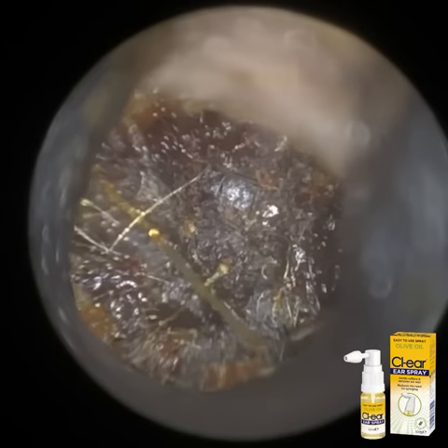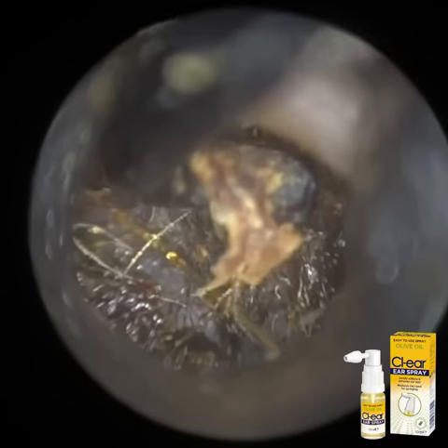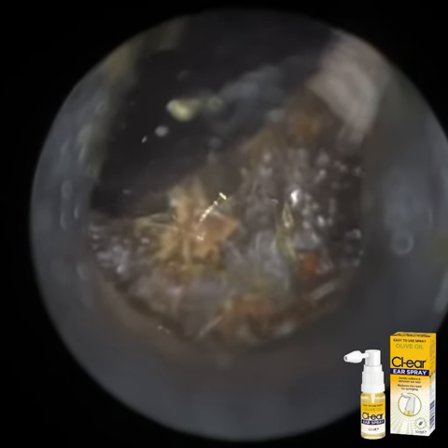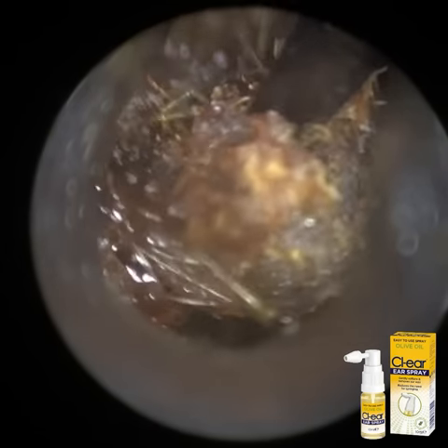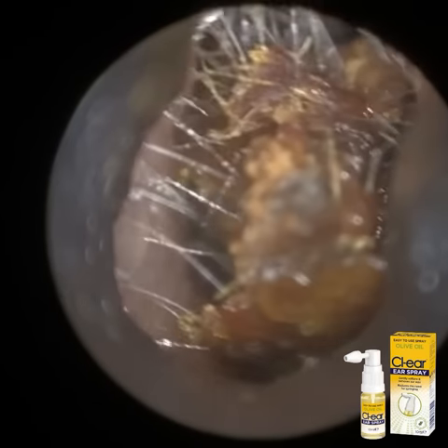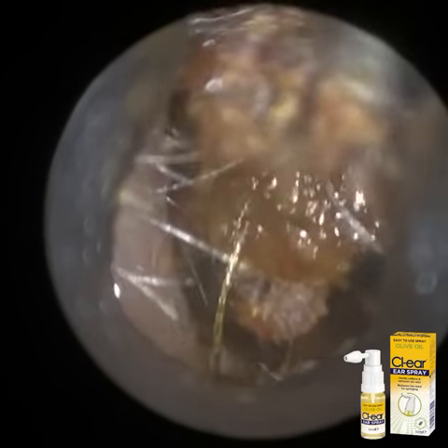So again, I'm just going to the roof of the ear canal. I've just adjusted the focus. I'm going to insert the ear hook again, and I'm going to try and get into the core, into the middle of this. So I'm just going to turn it now. And once more, I'm just dissecting this wax into little pieces. But this time, as I was removing the hook, some large chunks of wax also came out. If you watch till the end, you'll see a still image of all the wax I extracted from this patient's ear. It's quite a significant haul.